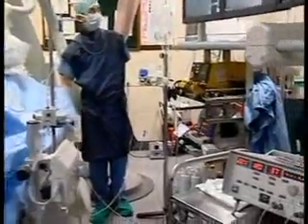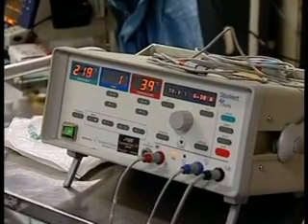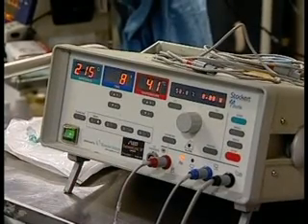Can you go on the pedal, please? Show the RF generator, please. 210 is the impedance on the first column, which is fluctuating. Can you go on RF? As the RF is being delivered, you can see the impedance is dropping from 220 to 214, 215.